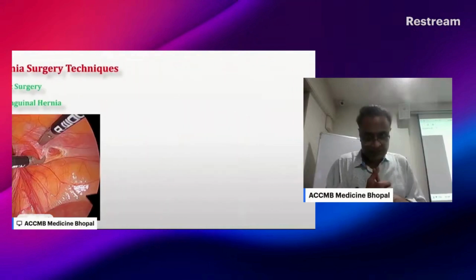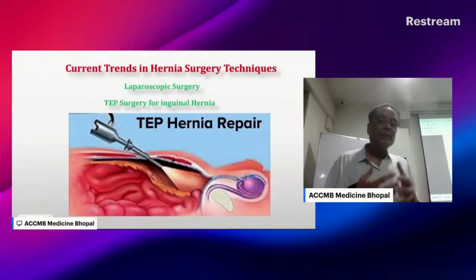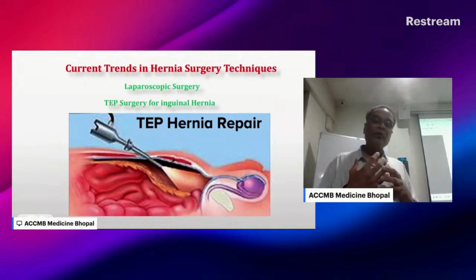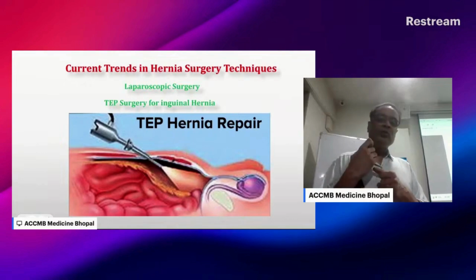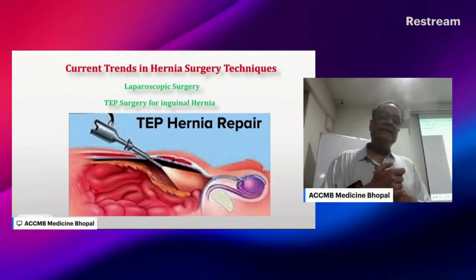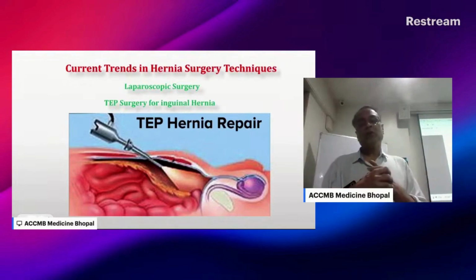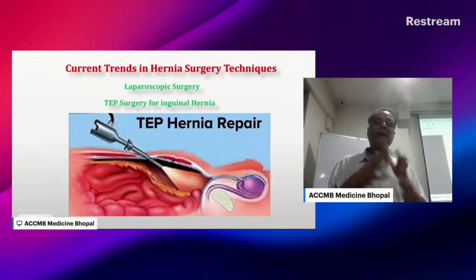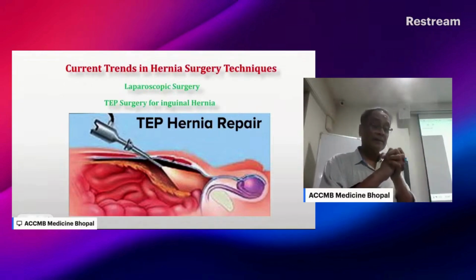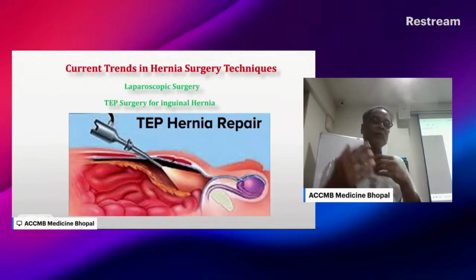The next surgery is called TEP surgery. TEP hernia surgery means we go above the peritoneum. So how do we go above the peritoneum to close the inguinal defect? We have to inflate a specially designed balloon. We fix it with the cannula, then inflate it. Nowadays, a ready-made device is available, which creates a space above the peritoneum. By pressing the peritoneum lower down, we reach up to the inguinal region, and then we close the hernia. So this is called TEP hernia repair surgery. But this surgery is much more difficult as compared to TAPP surgery.